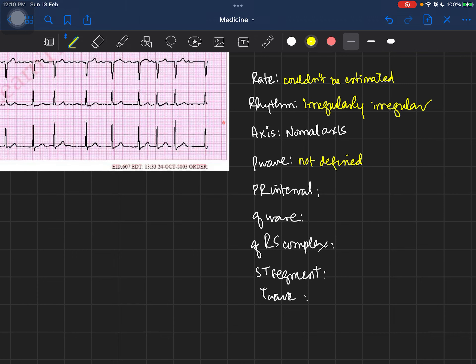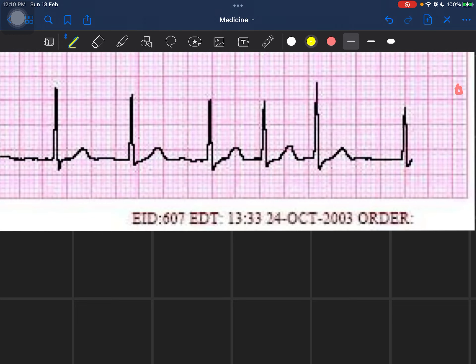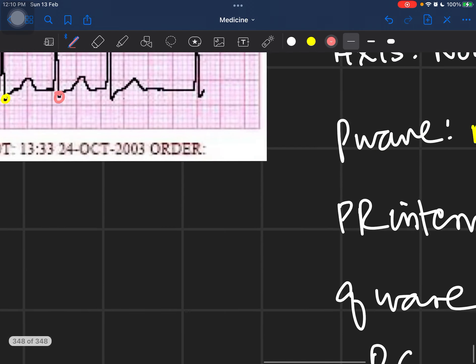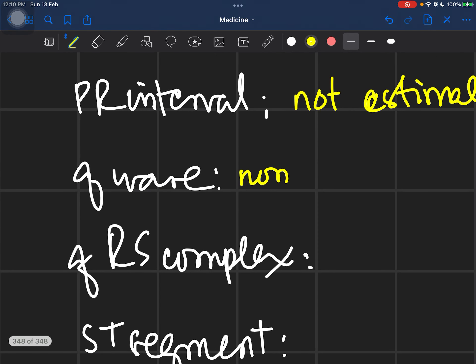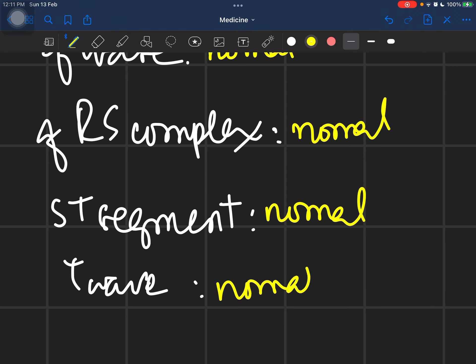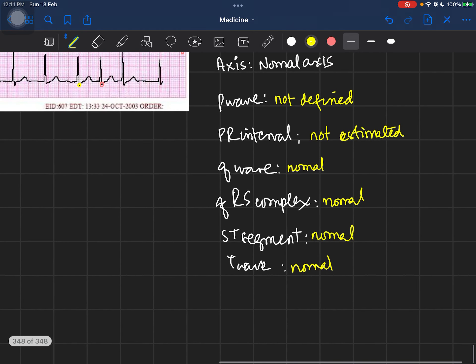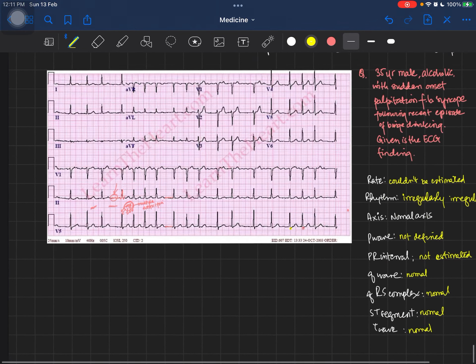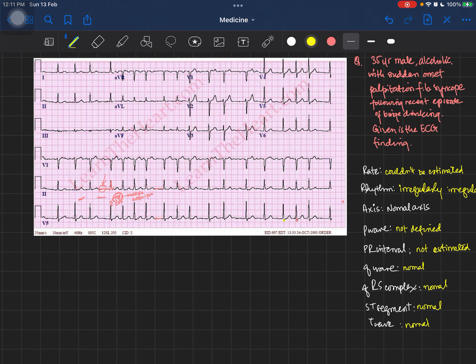Would you be able to measure the PR interval? No, because you don't have a distinct P wave — so the PR interval cannot be estimated. Other components would be normal because there is no reason for them to be abnormal in atrial fibrillation: the Q wave is normal (one small box in length and duration), the QRS complex is normal, the ST segment is normal, and the T wave is also normal.